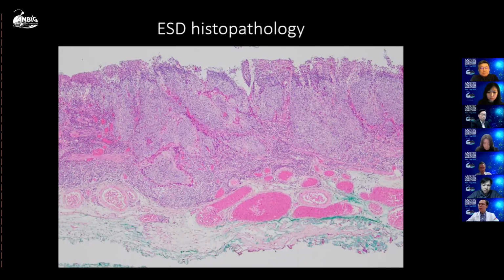Yes. Thank you. I have another question. Professor Inoue or Professor Zhang, because this patient received EMR first, then scarring and re-examination after healing, do you think the IPCL is still reliable after EMR?